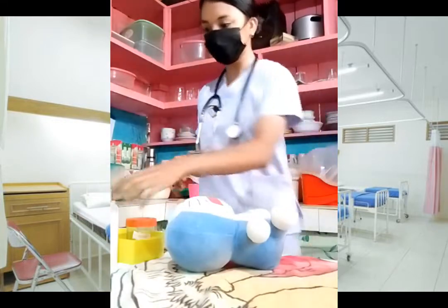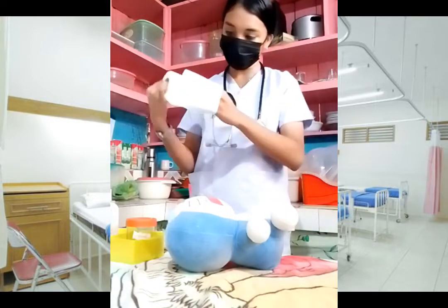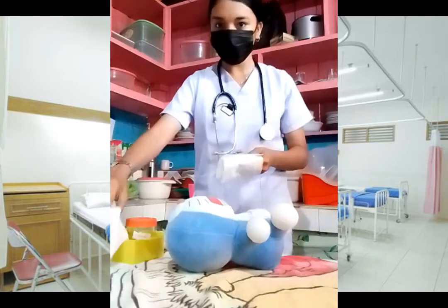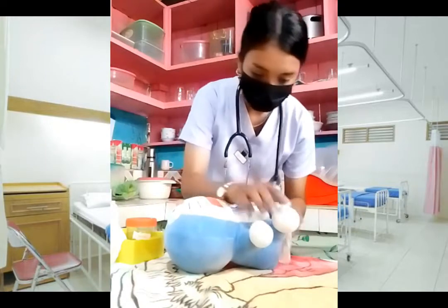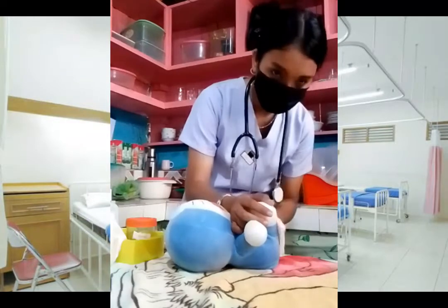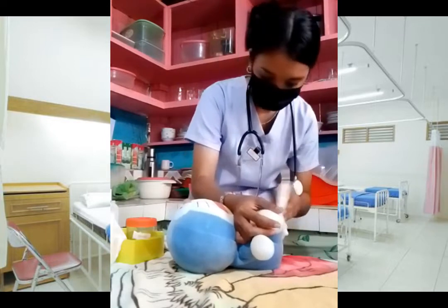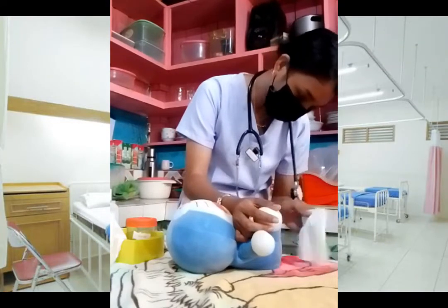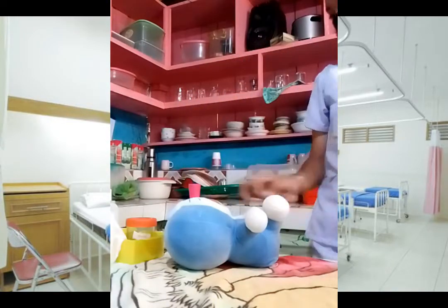Identify the client, explain the procedure to the child's mother, cleanse and dry the child's perineum, and apply the urine collector to the child by placing the child's penis through the opening of the collector for a male, squeezing the opening of the collection bag over the child's urinary meatus, avoiding extension over the anus. Place a clean diaper on the child, wash your hands, and check the collector every 15 to 20 minutes. Remove the collector if already filled with urine and place a clean diaper on the child. Pour the urine into the specimen container, send it to the laboratory, and don't forget to wash your hands.